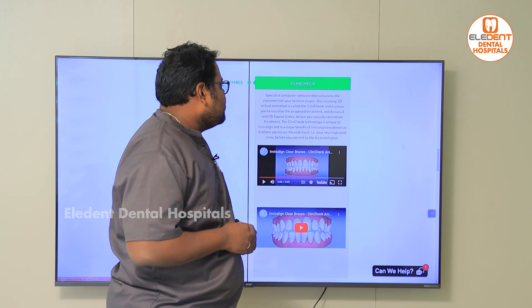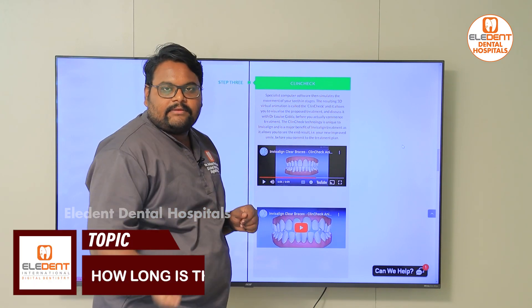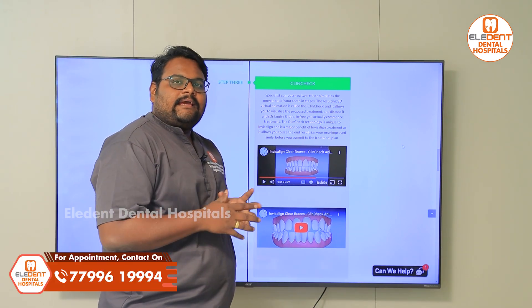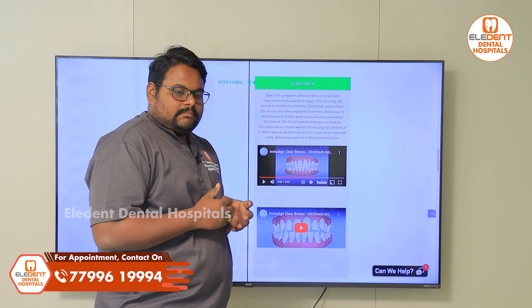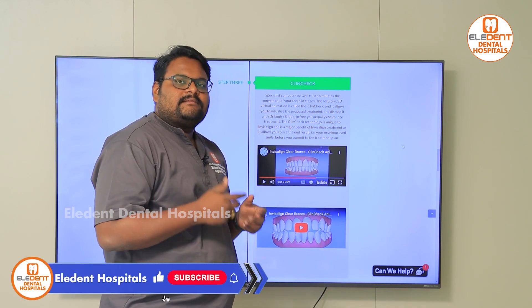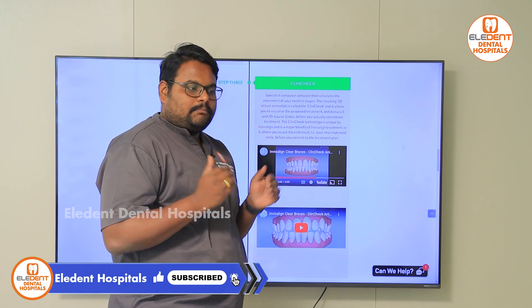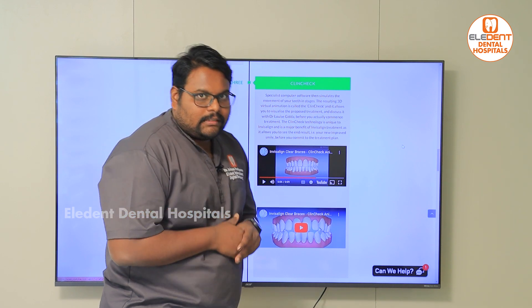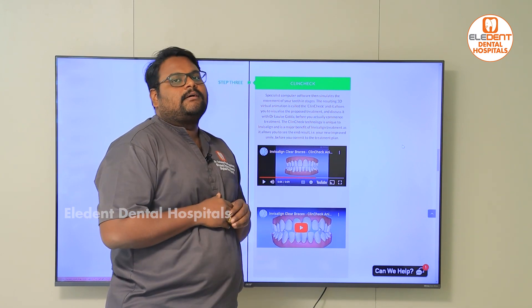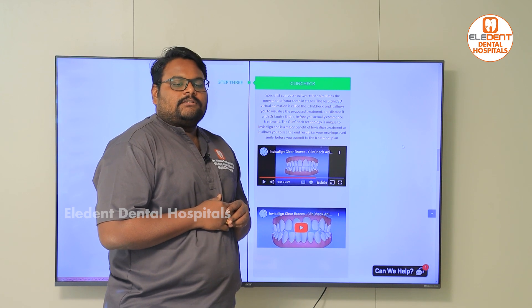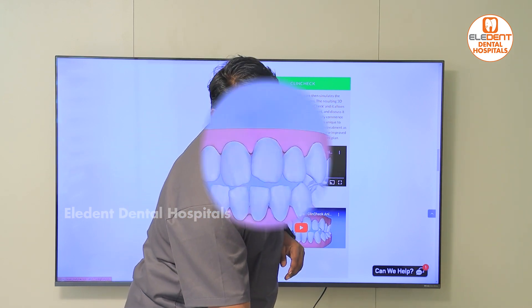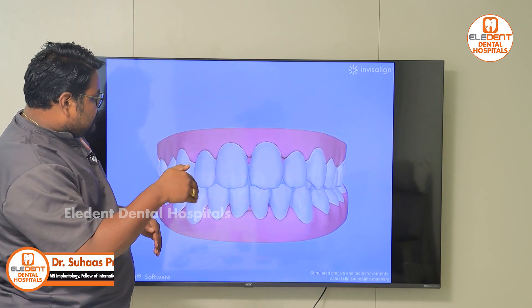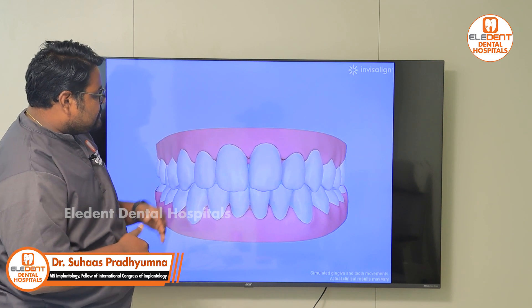The third step is the ClinCheck. The file taken with the intraoral scanner is sent to Invisalign, and using their AI software they decide the treatment plan — the number of sets necessary and all the movements required. They incorporate all of that and send us a final simulation of the final output. As you can see, each step represents a step-by-step movement, where each step is a set of aligner movement that is achieved.